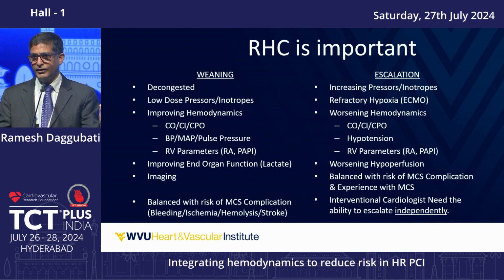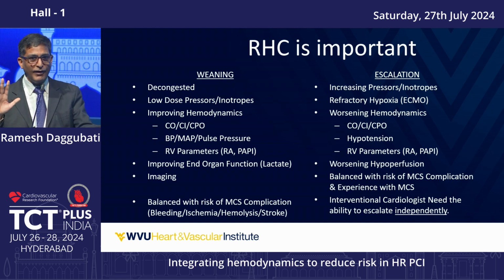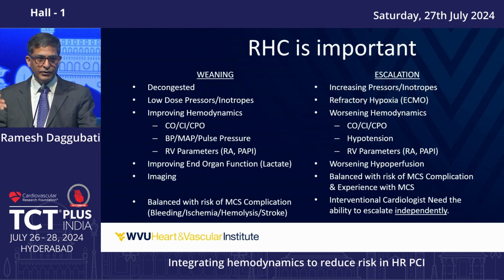So that's actually very nice and easy. If the patient was randomized to the Impella arm, you have to take right heart catheterization at every step. So if the patient's saturation, which in my patient was 63%, falls, or if the blood pressure falls and the PA systolic pressure or PA mean pressure drops, we have to wait on the device until it comes back up to at least within the range of 20%.